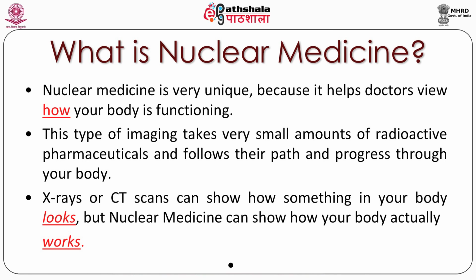Nuclear medicine is very unique because it helps the doctor view how your body is functioning. As we defined in our previous slides, the other imaging techniques are X-rays, CT, MRI. Then why is nuclear medicine there? We are emphasizing it because it tells about the functioning of the organs, the functioning of the body.